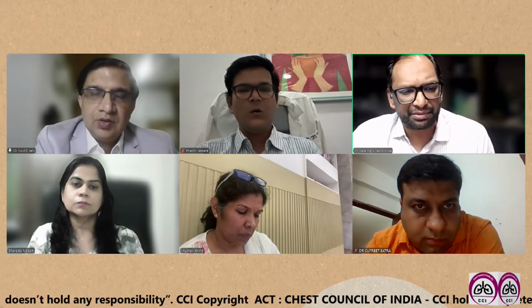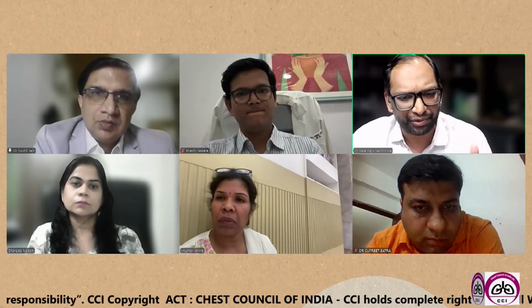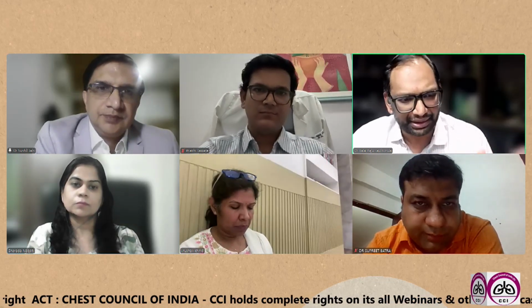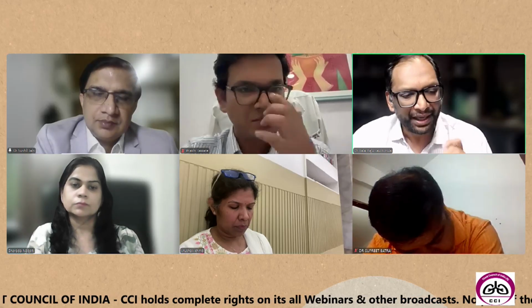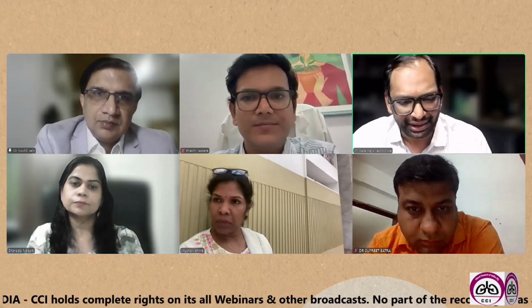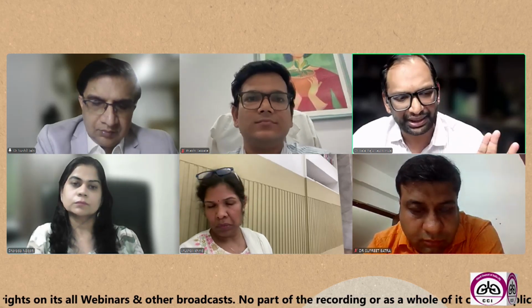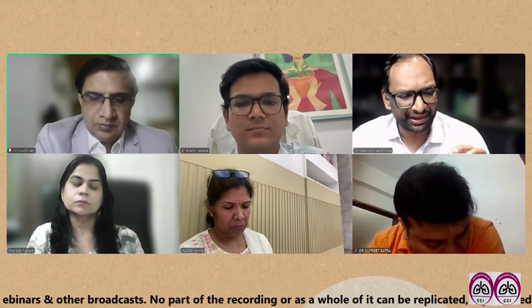This especially happens when you have nodes at two important locations. One is the 4L and the 10L. These are very, very tricky stations. They are not as easily accessible as 4R or 7 or whatever it may be. And lucky for us, most of our EBUS is either 4R, 7, 11, 10 or 10R or something. Most of the times, in less than 20% of the cases, only the 10L and the 4L have to be sampled. So I feel this is part one.